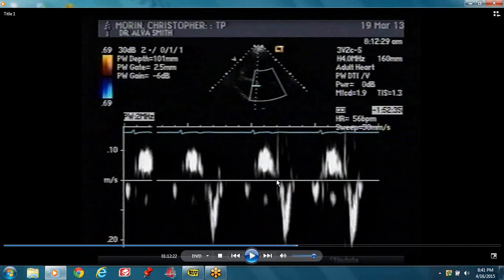Then you have two diastolic components: the early diastolic component — E prime — and the late diastolic component — A prime. So this is S prime, E prime, A prime. Tissue Doppler — it's a pulse wave Doppler.